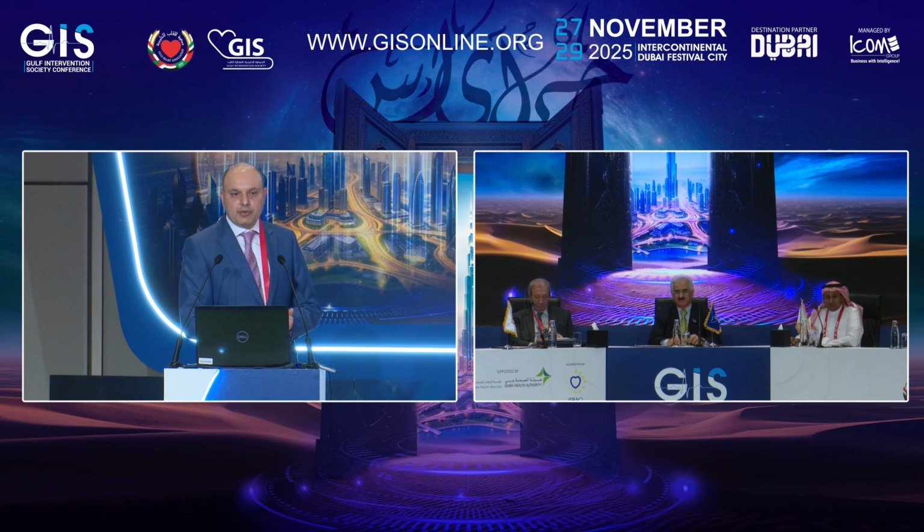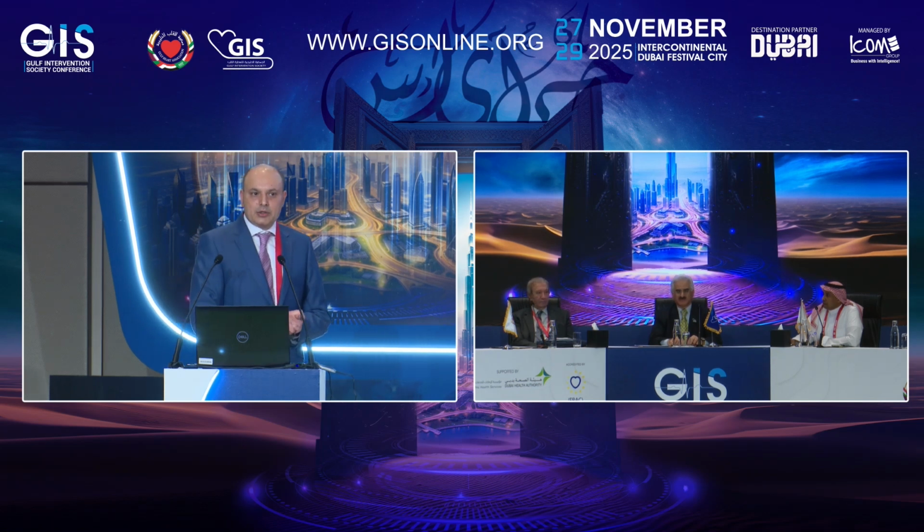So the conclusion is that it's best to have your strategy before starting the procedure, whether you would like to go upfront with rotational atherectomy, orbital atherectomy, or balloon-based modification of the lesion. After modification, it's best to recheck and further pre-dilate, ideally with the scoring balloon, to ensure that the lesion is well prepared, and then deliver the stent and post-dilate well.